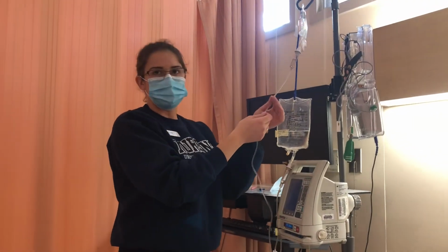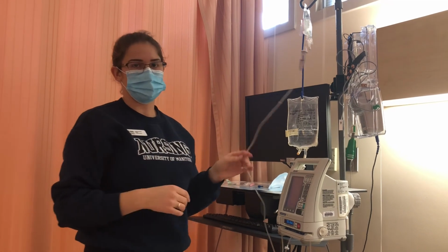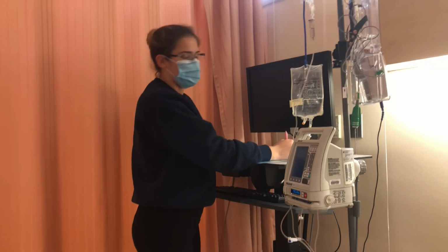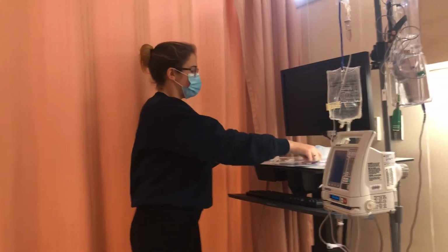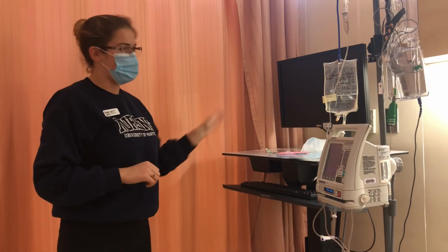I would label my secondary to make sure that people know when this has been put on, so when it needs to be changed. I'm going to document on my MAR. I'm going to put my initials, the date, and the time, and I'm going to mark the amount on my in and out record for the amount that I've infused.